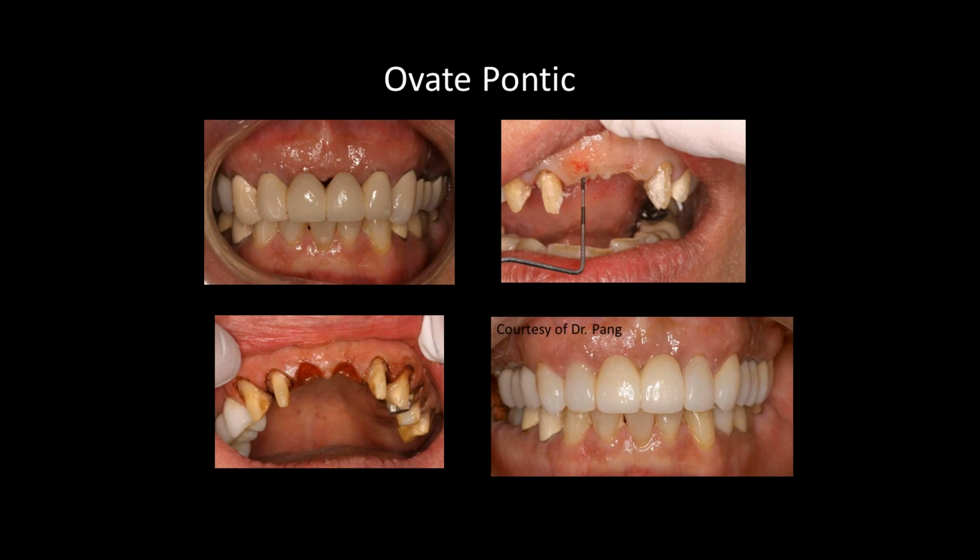Yes and yes. If you turn your light down or do it indirectly, maybe shine it on the patient's chin, your red aiming beam shows up better. The green one, I don't think it really matters. It is so intense that you can see it even with your overhead light. But yeah, I'll pull the light off the patient directly and put it on their chin, and then you can see it better.